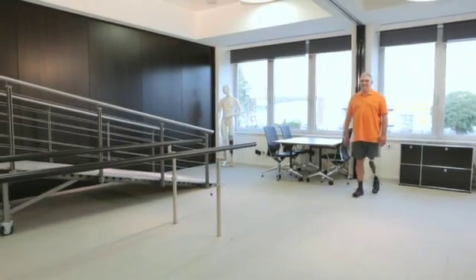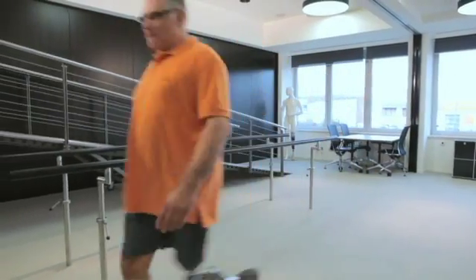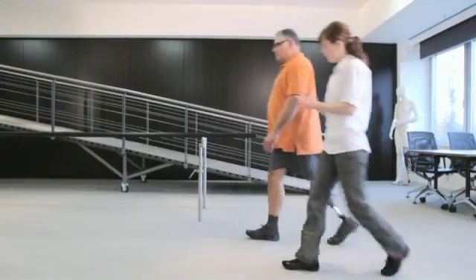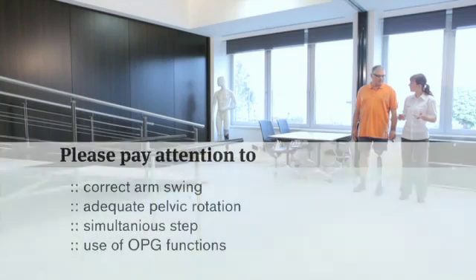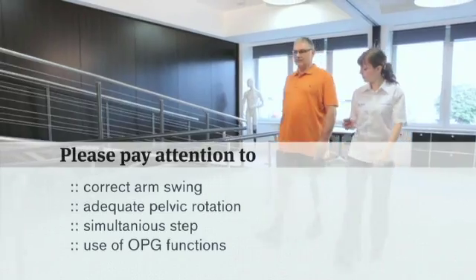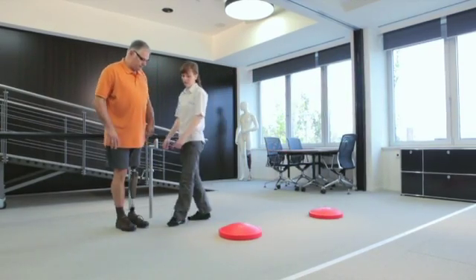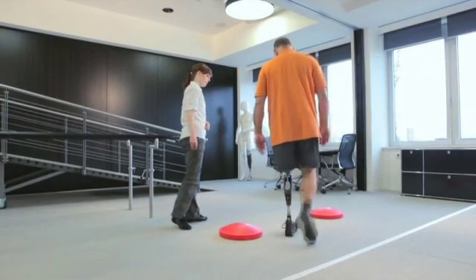Also have the user walk as quickly as possible while varying step length. To train the user to walk with different gaits, you can use a metronome or other type of feedback signal. Make sure that the user walks with the following characteristics: correct arm swing, adequate pelvic rotation, simultaneous step width and step length in combination with good body posture, and use of the OPG function during stance phase. Have the user walk in different patterns while maintaining a focus on these goals.